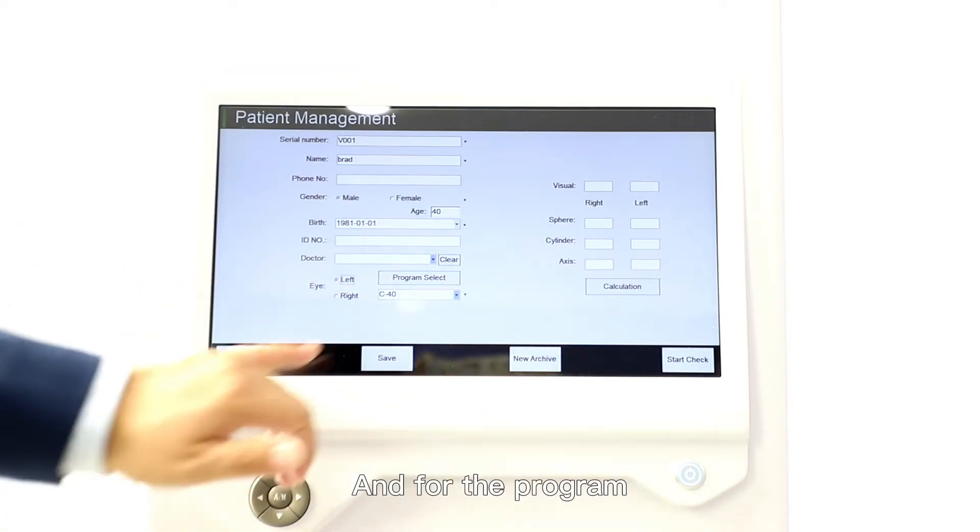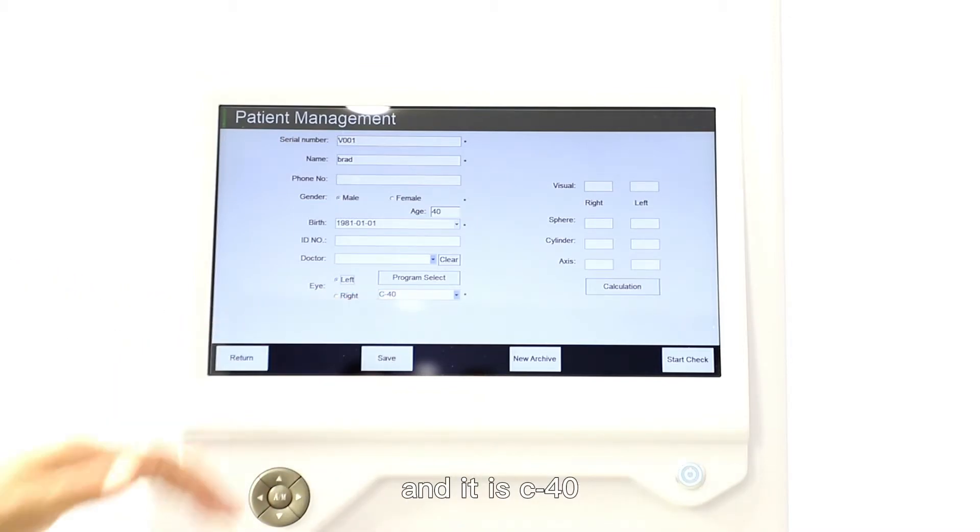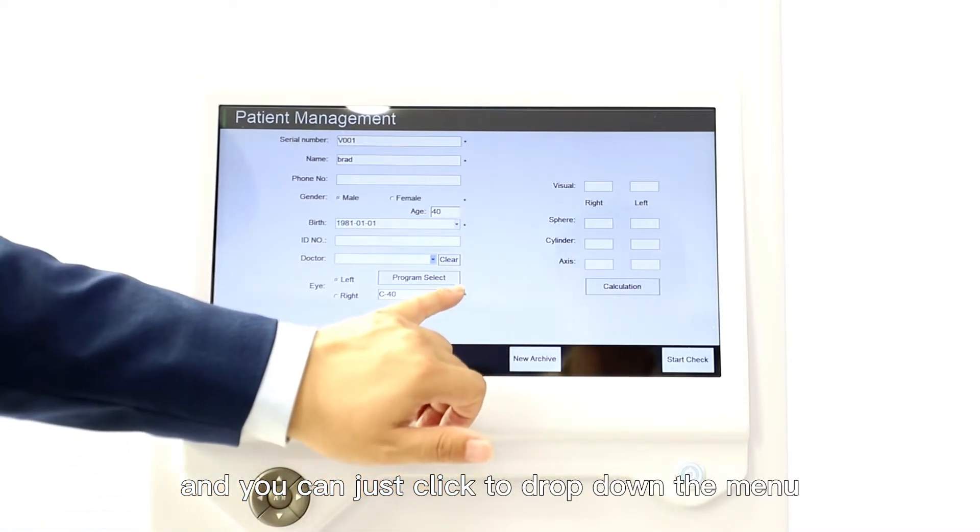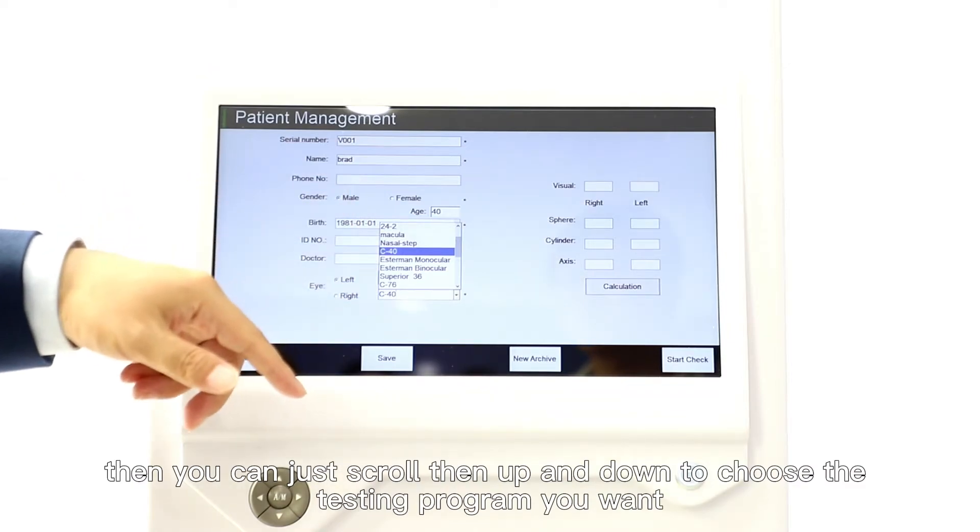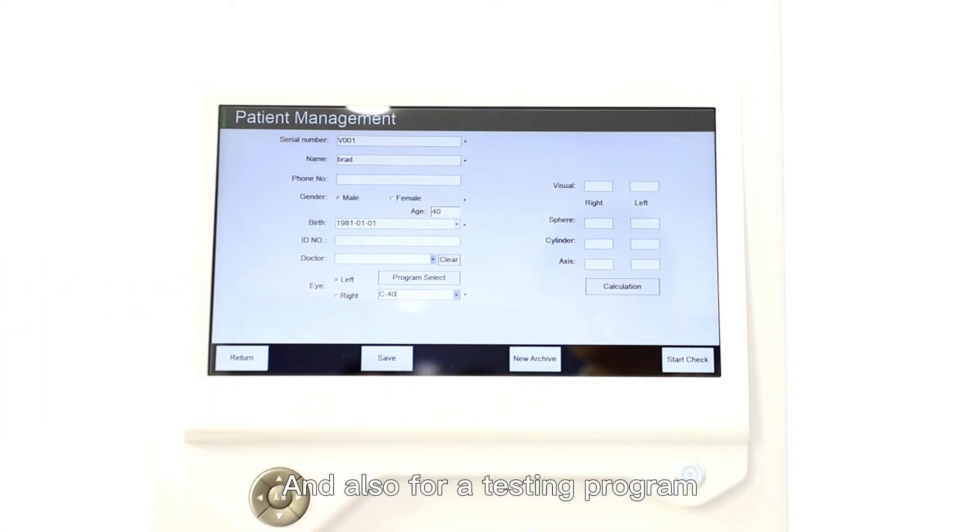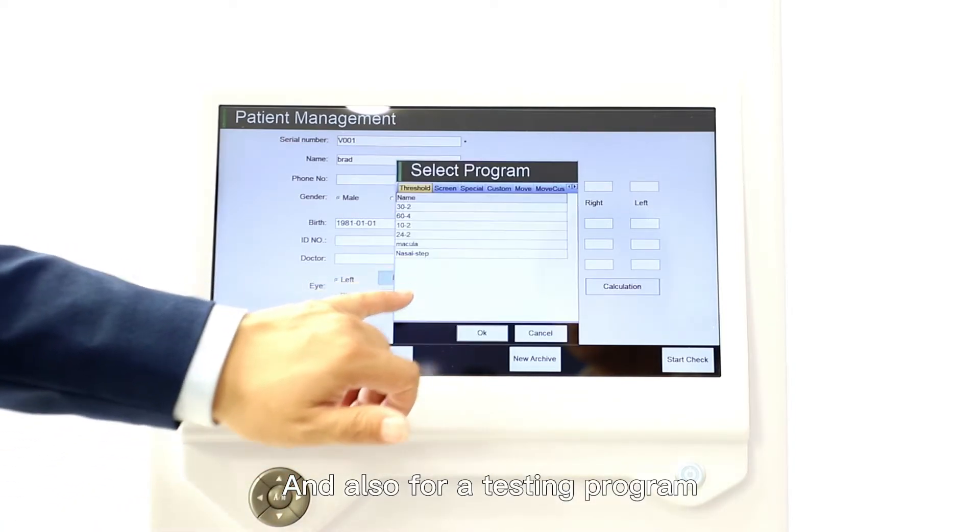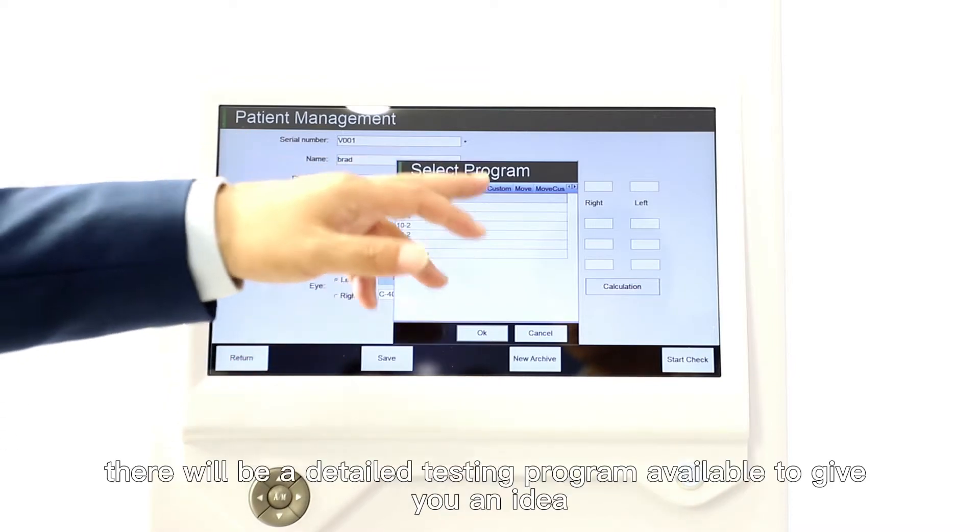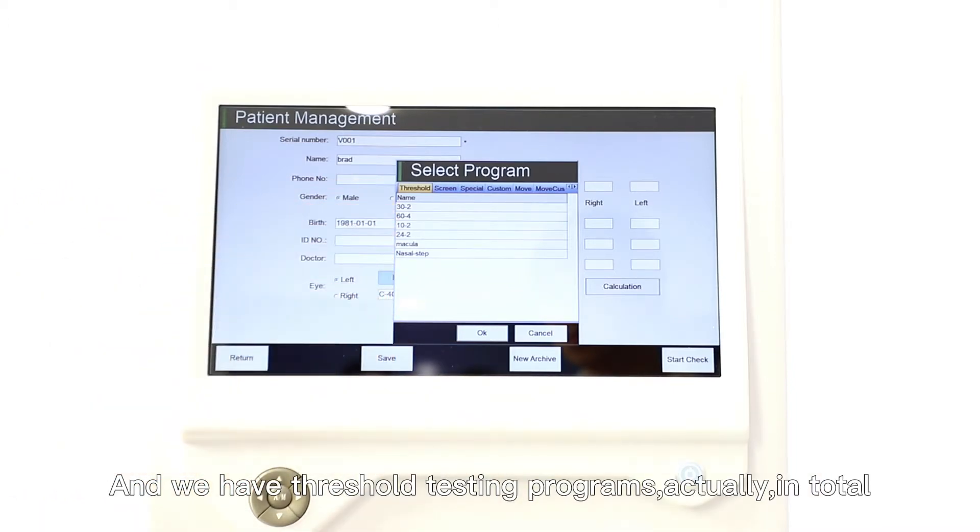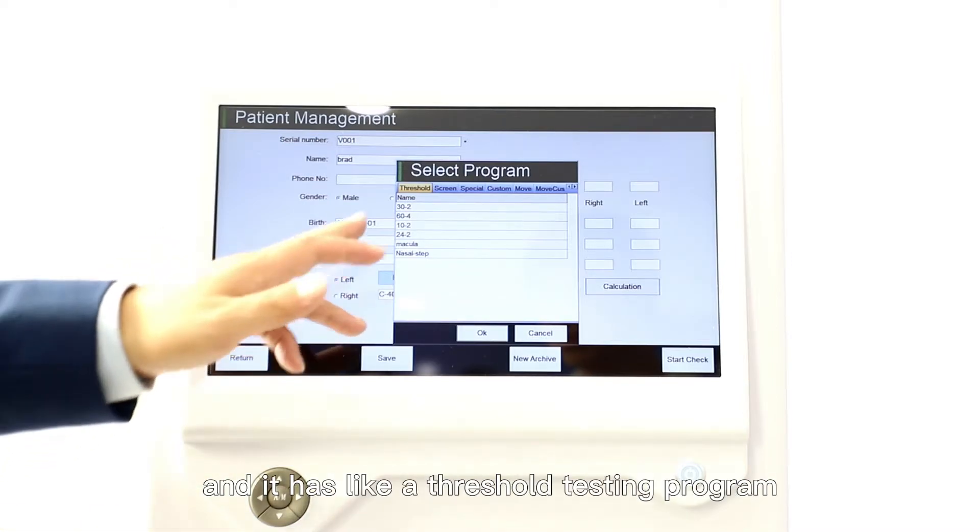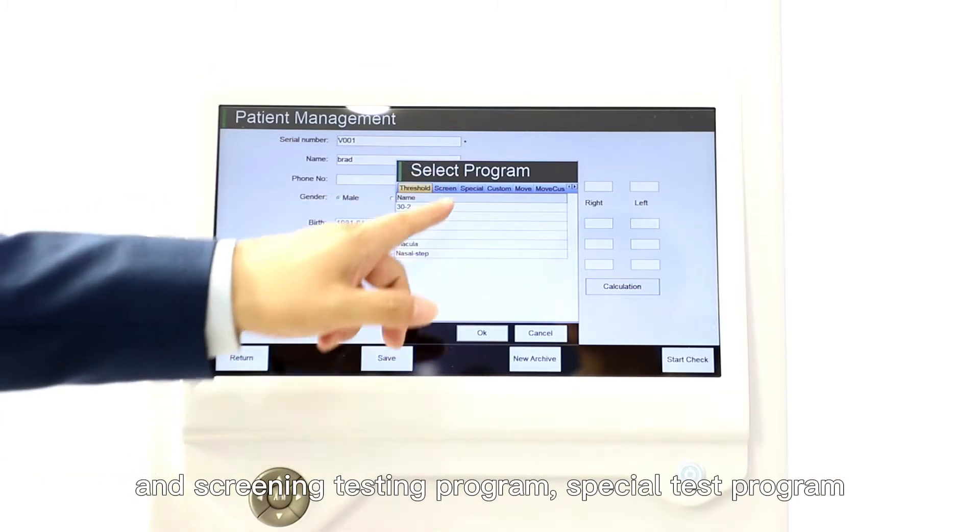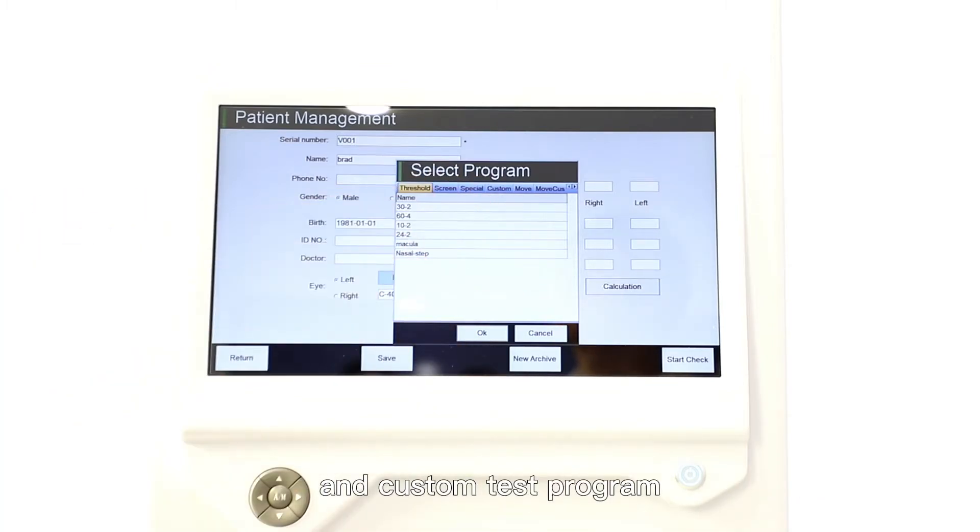For the program, this is a default testing program, C40. You can click to drop down the menu, then you can scroll up and down to choose the testing program you want. For the testing program here, if you touch it there will be a detailed testing program available to give you an idea. We have threshold testing programs. Actually in total we have 22 testing programs available.